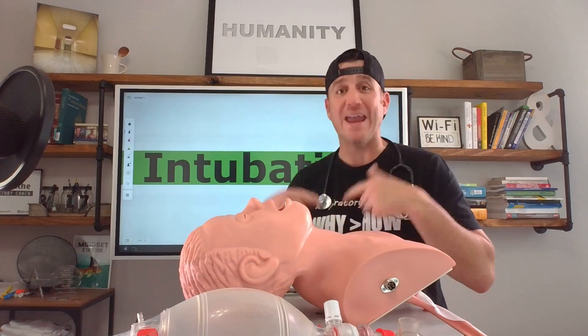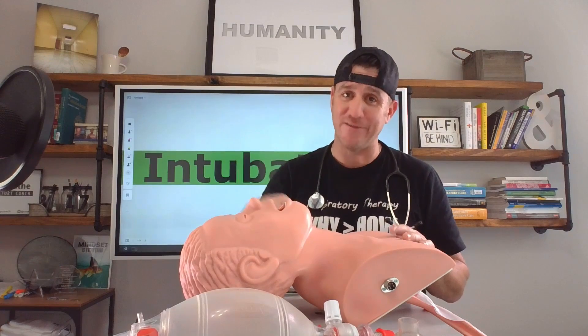What's up future respiratory therapists? In this video, I'm going to walk you through and talk you through the intubation process. This is part two. Let's dive in.